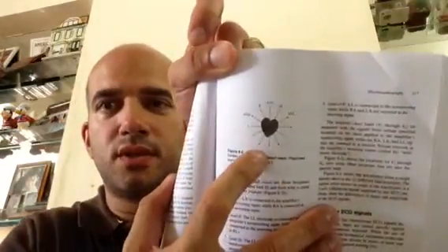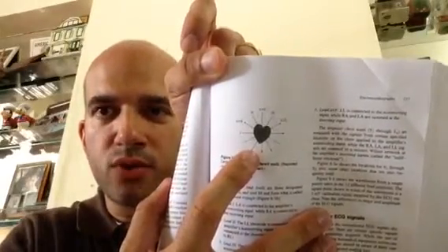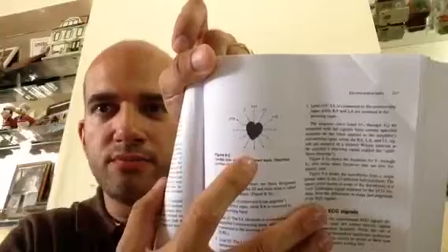We have a figure here, figure 8.2, that shows the electrical axis of the heart that is examined by 6 of the standard leads. This would be the picture right here, and it shows all the leads. It looks a little backwards on the video, but you'll get the idea. That's pretty much how it works.